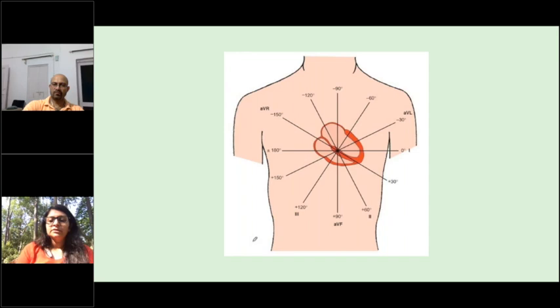So you know, in math, you would get those graph papers and draw out graphs. So literally this is what it is, okay? So you have lead 1, which is at 0-degree angle, and then just take another angle, which is AVF, which is at 90 degrees to lead 1. Okay, so in math we had all drawn that, right? We had all drawn one x-axis and one y-axis.